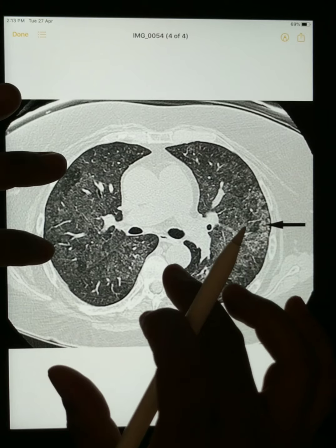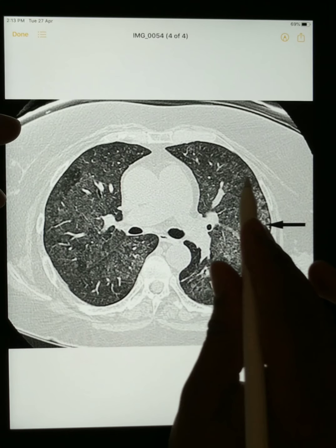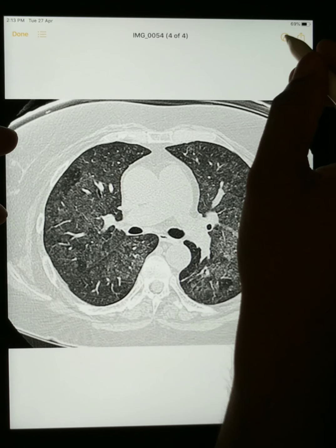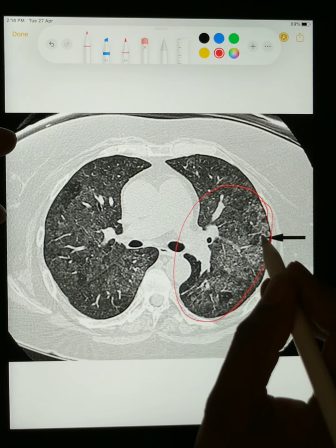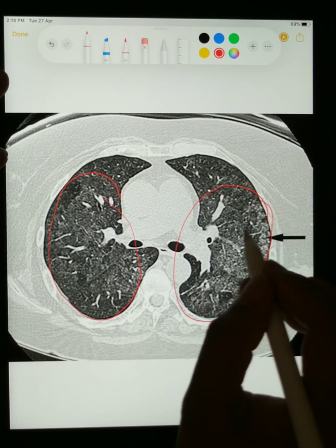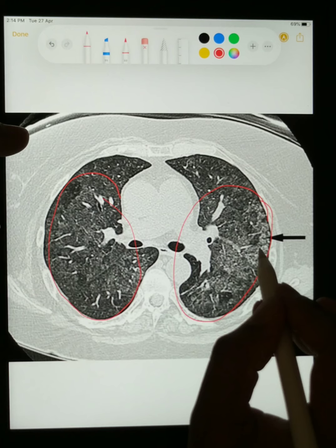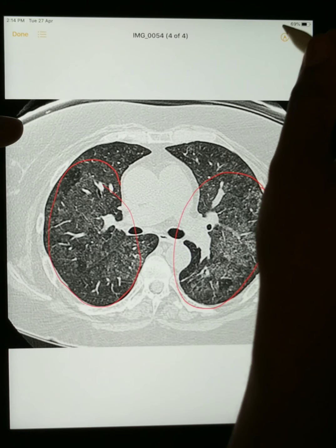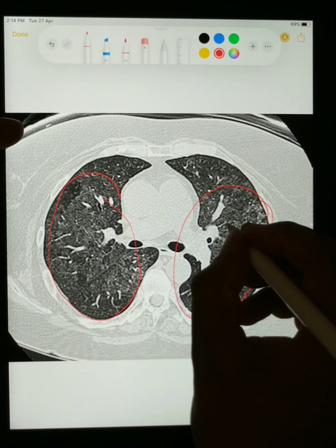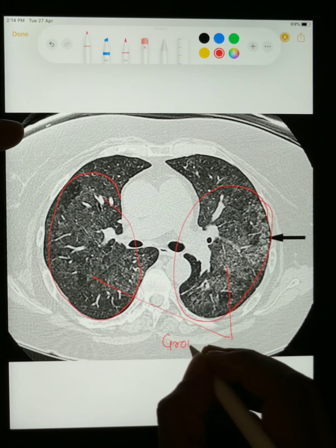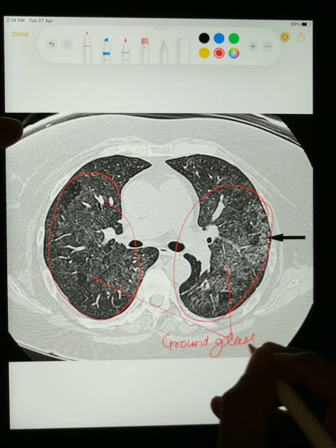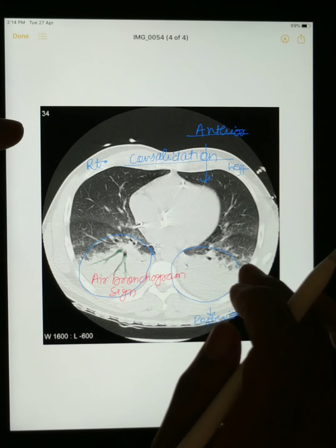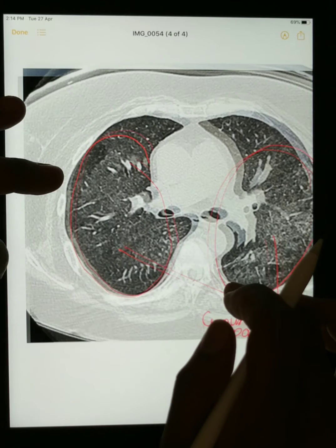Now the second finding is ground glass opacity. What is ground glass opacity? In consolidation the whole area is white, but in ground glass opacity there is a mixture of white and black areas. You can appreciate this is not completely white and not completely black — in the bilateral lung fields there is a grayish area of haziness. This is known as ground glass opacity. So now you can easily differentiate between ground glass opacity and consolidation. This one is the area of ground glass opacity.